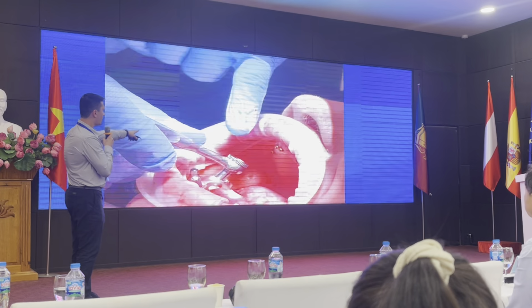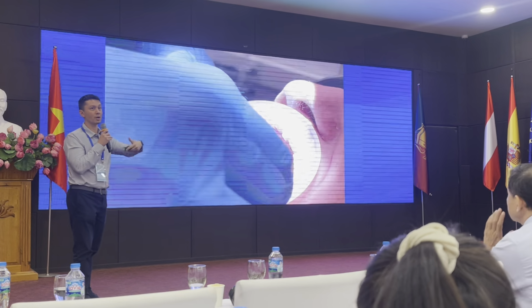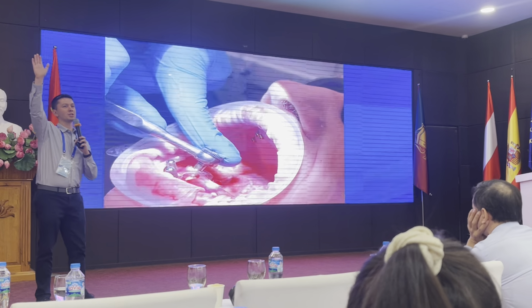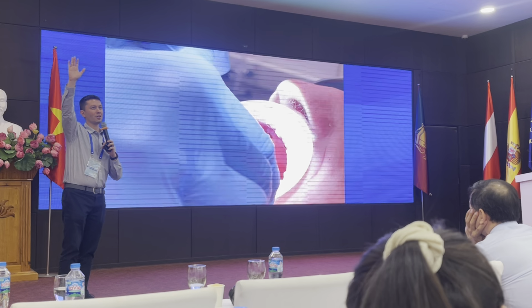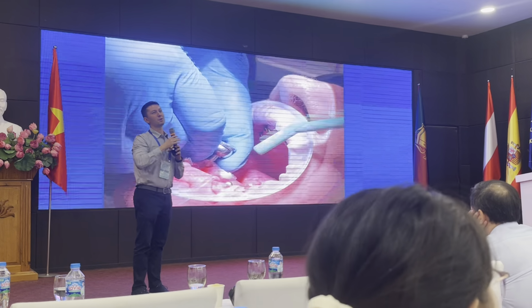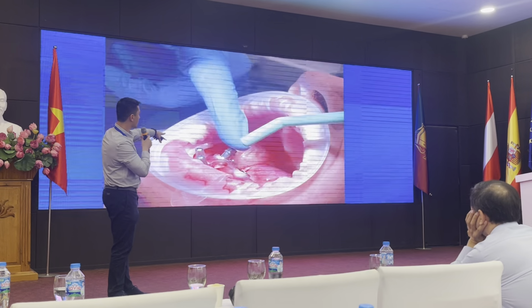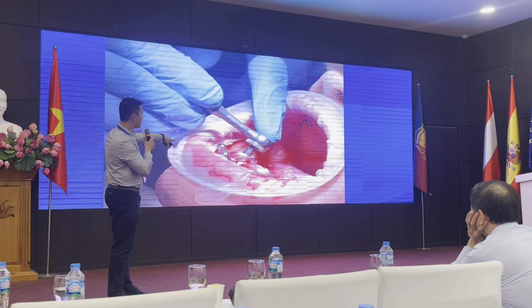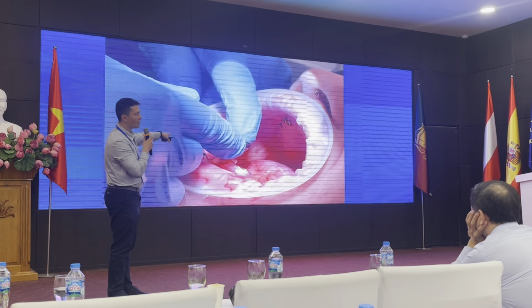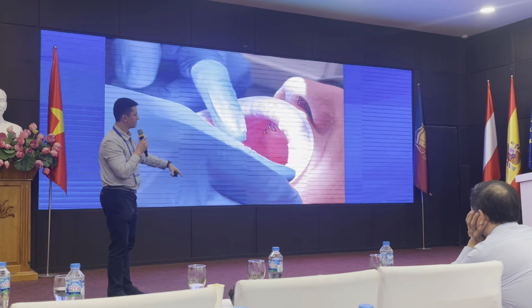So notice I'm stabilizing the head of that torque wrench with my other hand. So I'm right-handed. How many of you guys are right-handed? A lot of us, right? Sorry, lefties. We still love you. But a lot of us are right-handed. So I use my left hand to stabilize the top part of that torque wrench, and that helps me protect from having anything come off of that instrument, or possibly the patient swallowing it.